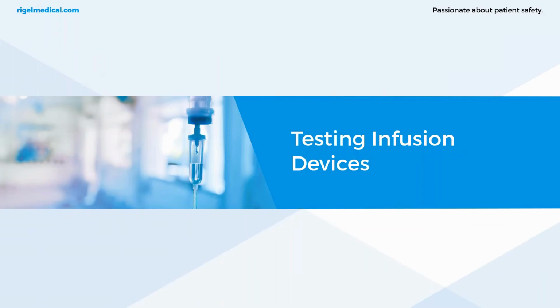So the reliability of infusion pumps is extremely important. This is because the devices are used, as previously mentioned, on patients that are in critical condition. Also due to the incidents that we've read about, we need to adequately validate the accuracy and the performance of these devices.